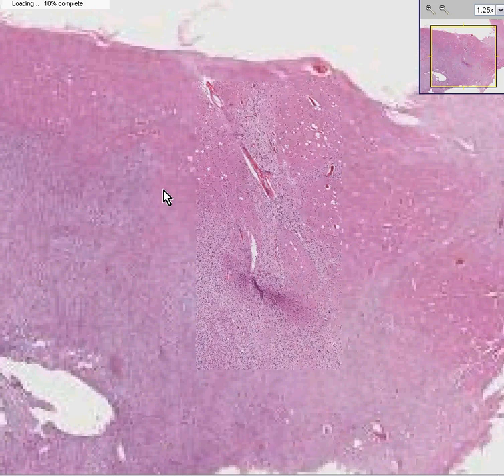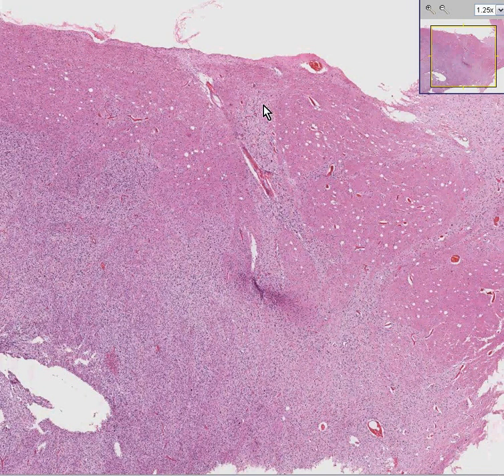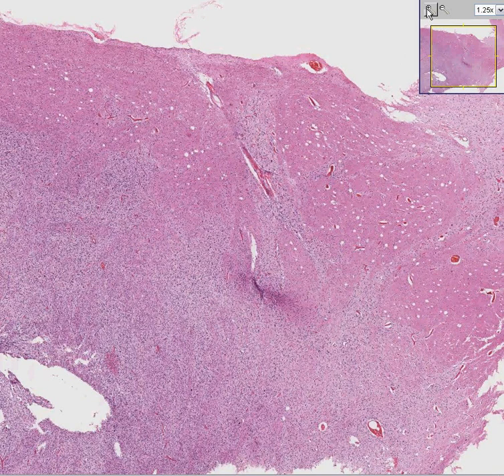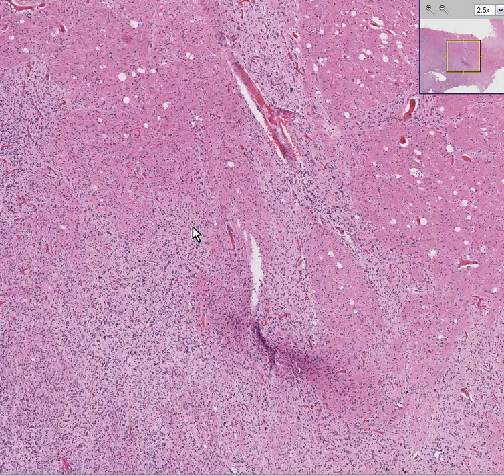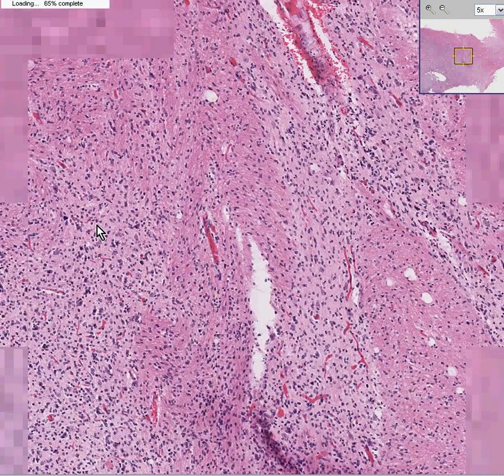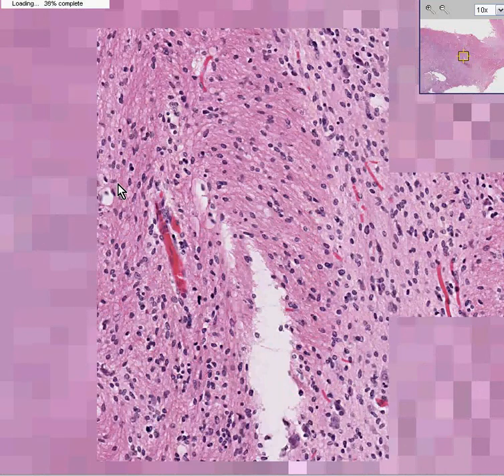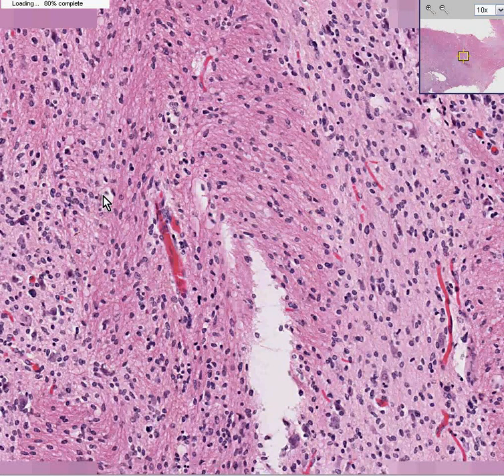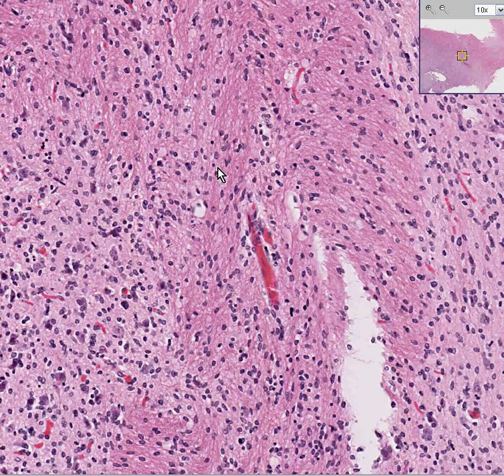Notice, once again, there's a pinker, more normal brain-appearing area, or perhaps terribly gliotic. But then the southwestern section looks very, very cellular. And not only does the southwest section look very cellular, but you could see, even though the cells here generally maintain semblances to normal glial cells, there is a little bit of a variation in size and staining properties.